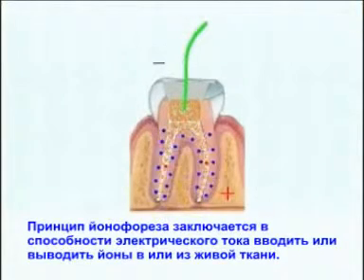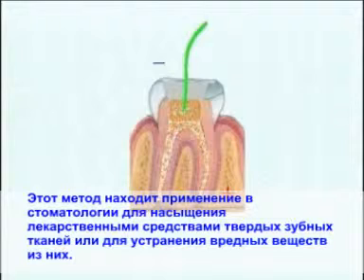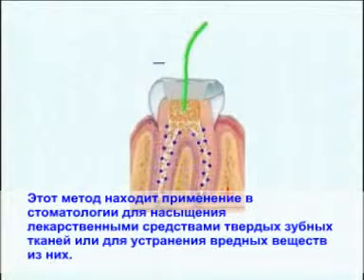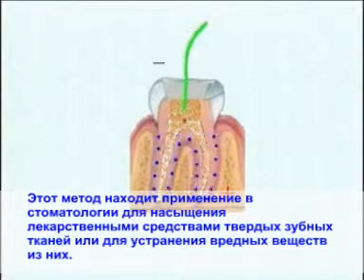The ionophoresis principle consists of the electrical current's ability to take ions in or out of vital tissue. This method is used in dentistry for saturating hard teeth tissue with medicines or for excluding harmful substances.